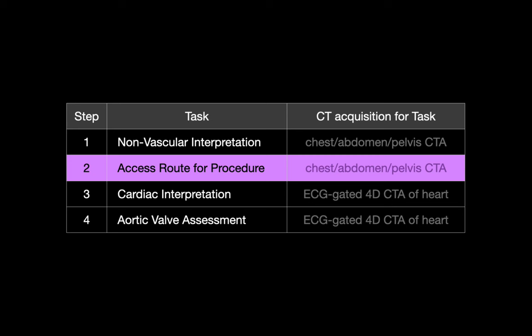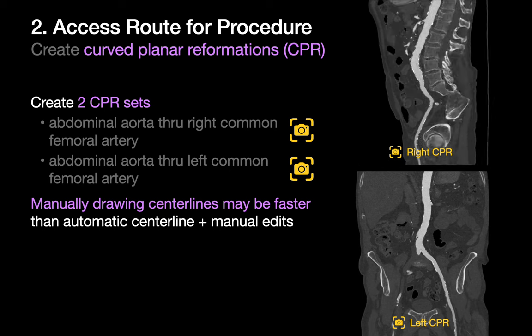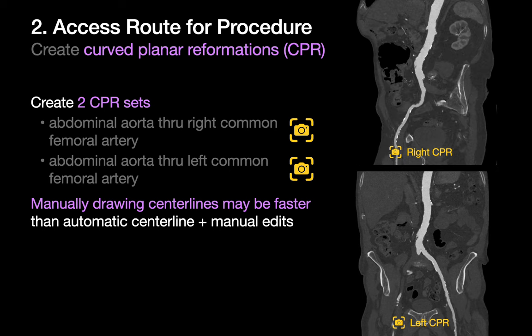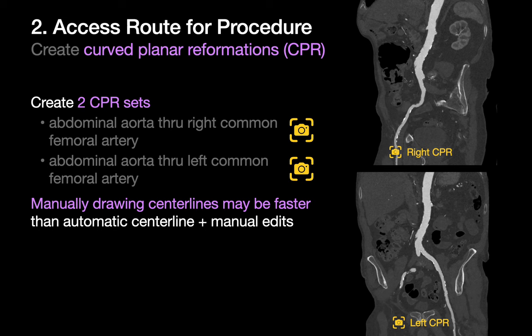While the axial source CT images coming directly off of the CT machine can provide a rough preliminary assessment of the access route, dedicated measurements must be performed using a 3D workstation to avoid substantially overestimating some access vessel diameters. You'll begin by creating two curved planar reformations — one of the abdominal aorta to the right common femoral artery, and one of the abdominal aorta through the left common femoral artery. While most 3D workstations can automatically draw a vascular center line, you may find it's faster to manually drop an entire line of center line dots yourself the old-fashioned way.